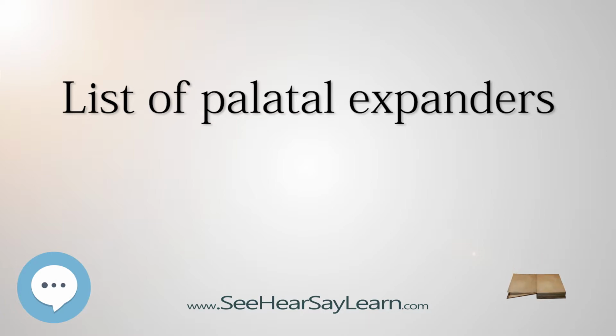Comparison of different types. Many studies have been performed and published regarding the comparison of these two different types of appliance. It is important to note that the discrepancy that exists between different studies has to do with the type of appliances they used in each category. A tooth-borne appliance can be designed in many different ways and same with tissue-borne appliance. The expanding protocol, retention protocol, exact time point of when the expansion was measured are some of the factors that can influence the results between different studies. Therefore, when evaluating studies and making conclusions, it is important to keep these confounding factors in mind.